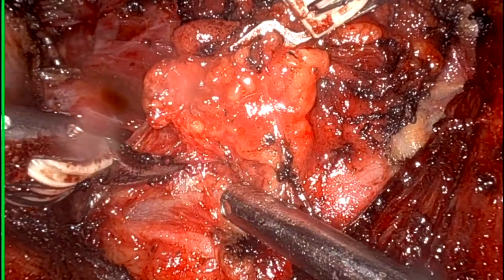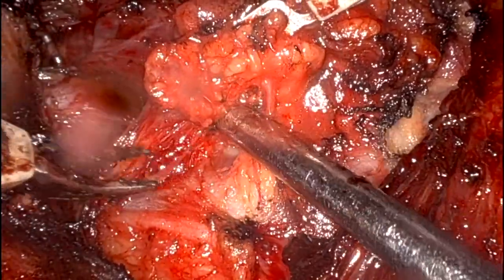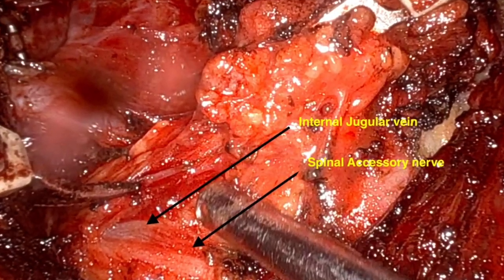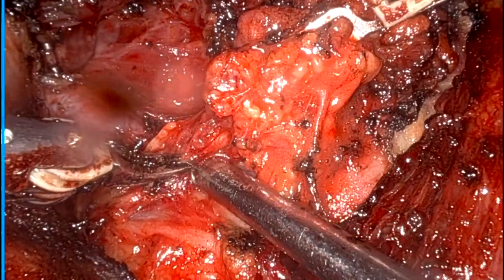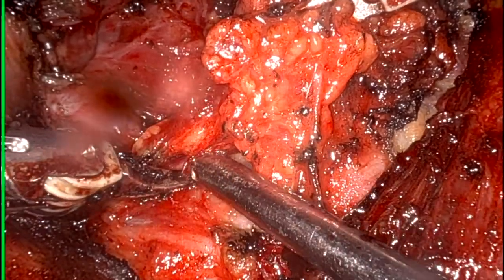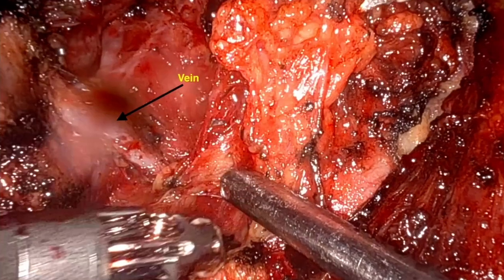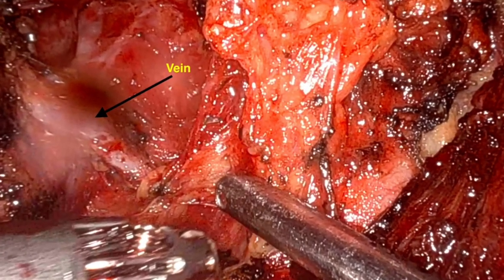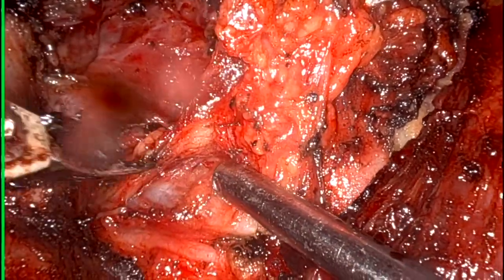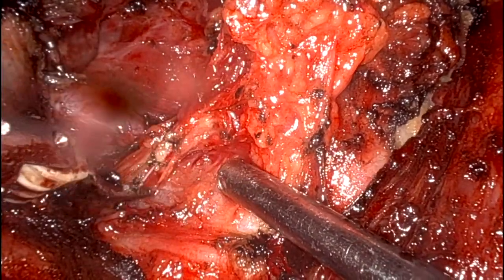Just above the spinal accessory nerve, we have internal jugular vein, crossing digastric muscle, and down there will be hypoglossal nerve and carotid artery, but we will try to preserve it as I have told you before also.